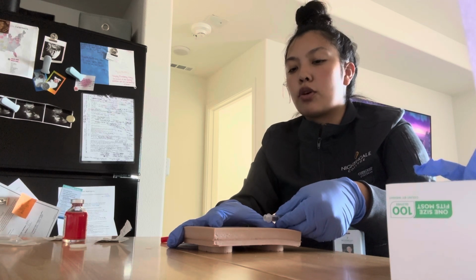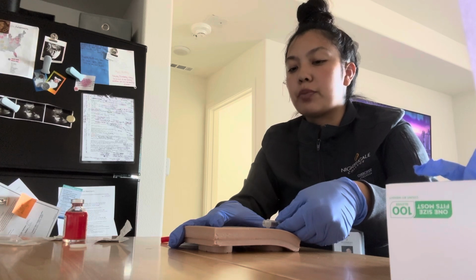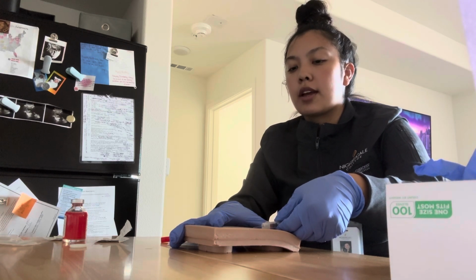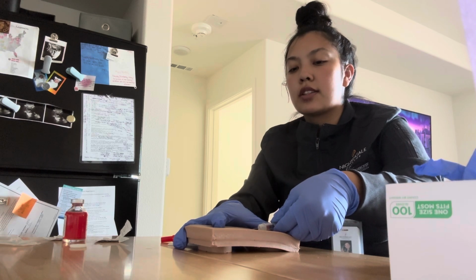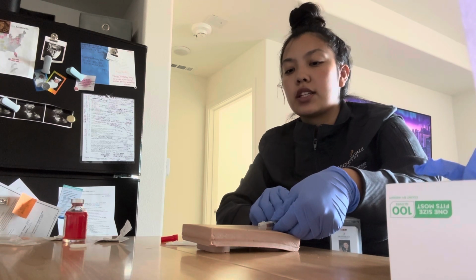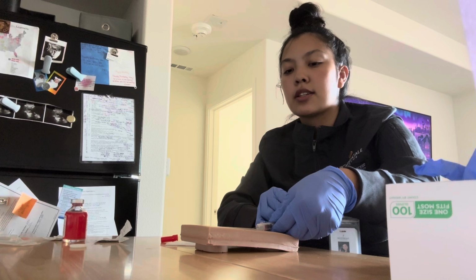And I'm also going to make sure the bevel is up, which it is. I'm going to insert. Perfect. I don't need to insert all the way, just enough to make sure that the bevel is all the way in. And then I'm going to inject.